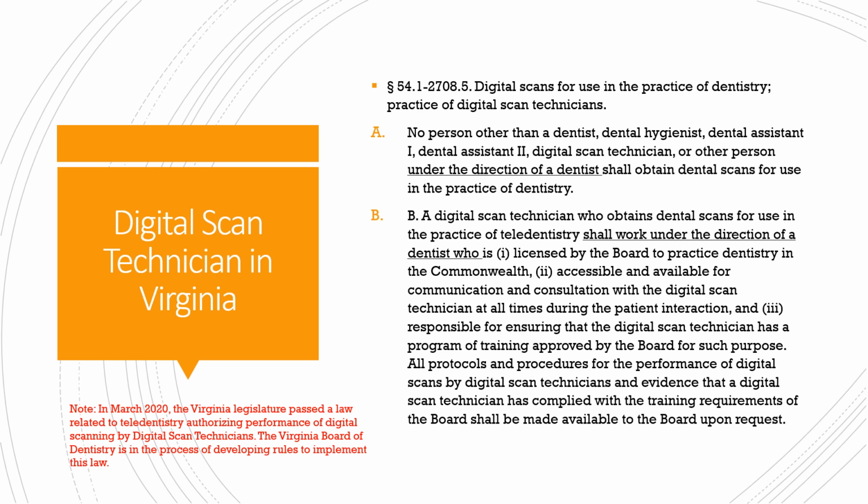Okay, so digital scans, this is straight from the Virginia Board of Dentistry. Digital scans are used in the practice of dentistry. No person other than a dentist, dental hygienist, dental assistant 1 or dental assistant 2, or a digital scan technician or other person under the direction of a dentist can obtain a scan. So it has to be under the direction of the dentist.